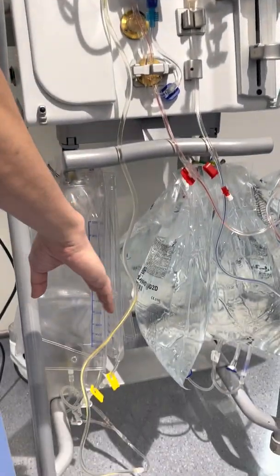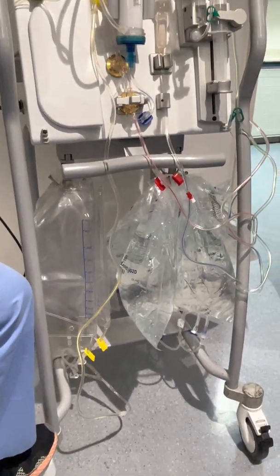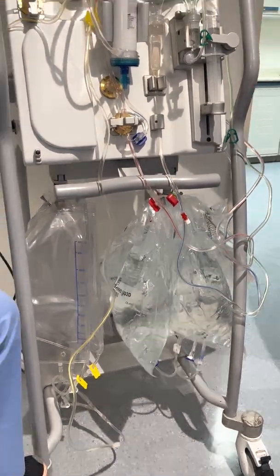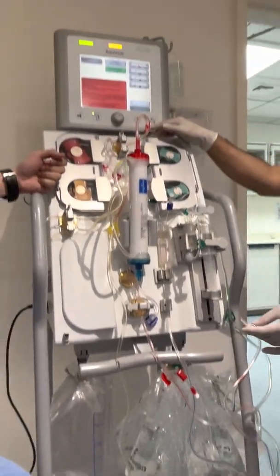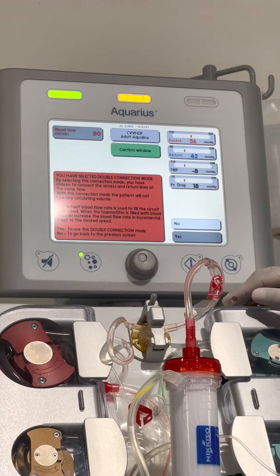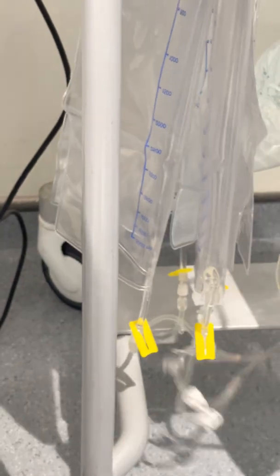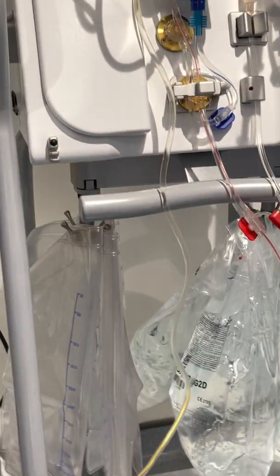It doesn't matter whether it's a fluid or dialysis bag. If it is not full, no problem. Just put the balance here. But we advise to change both effluent and dialysis, which is much better. It will only alarm if all of the bags are full.